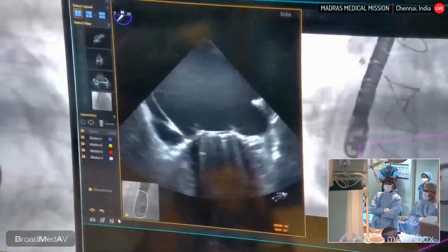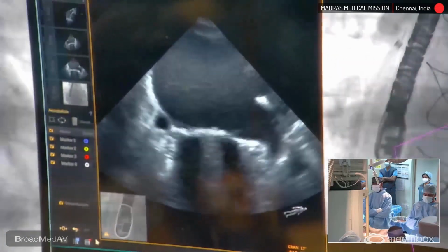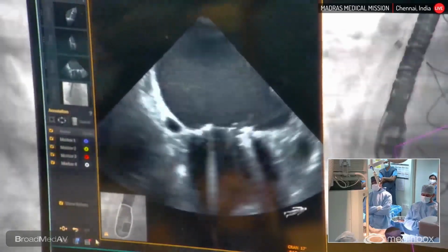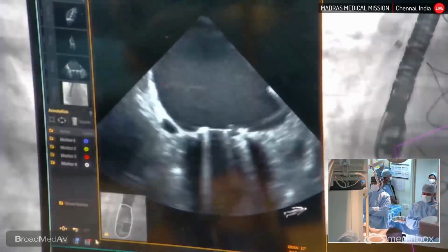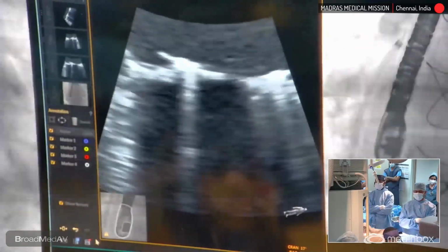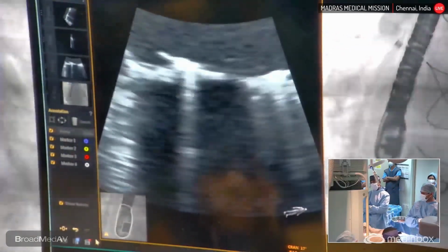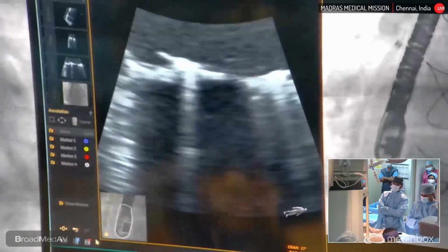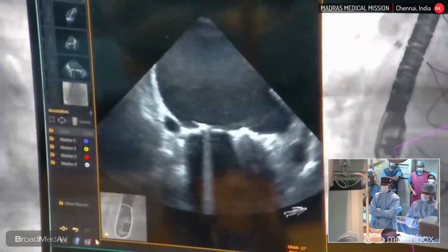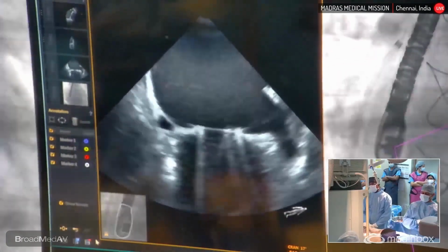I think if I remember, at somewhere around 90 degrees, we were able to see the valve leaflet perfectly. Can we zoom on the valve and show that maximum excursion of the leaflet? Yeah, here the valve is seen nicely. We can probably zoom on the valve and get it magnified so that we are able to see, and we can freeze it now when the valve is fully open. Yeah, perfect. So it's almost around 80 degree opening angle, and we are able to see that closing. So this is the valve leaflet mobility, and this has to be ascertained only by transesophageal echocardiography. It's a radiolucent disc.